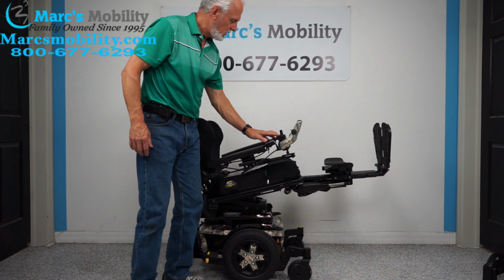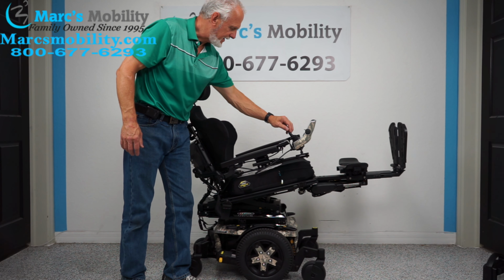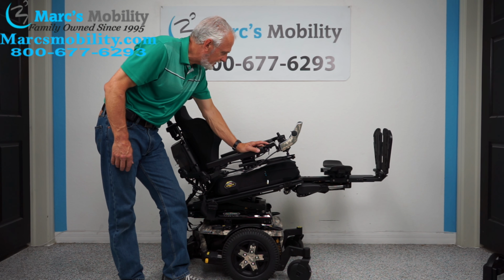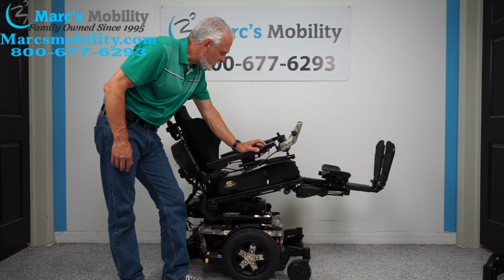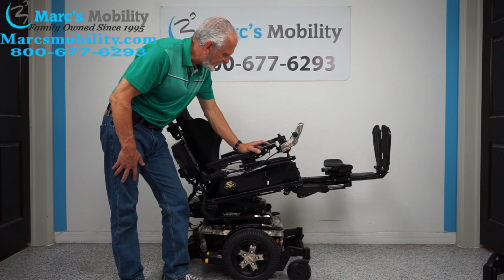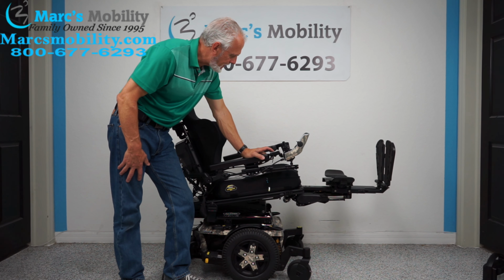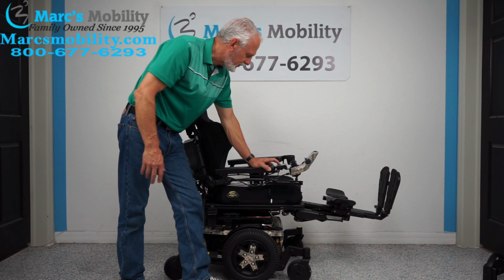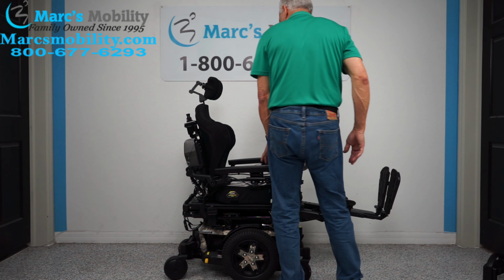We'll go, whoop, wrong button. Put that back here. We're going to bring the legs back down. Actually, let's leave the legs up. Let's bring the tilt all the way down. So we've done the seat lift, we've done the tilt, we've done the legs. So the last function is the electric recline.